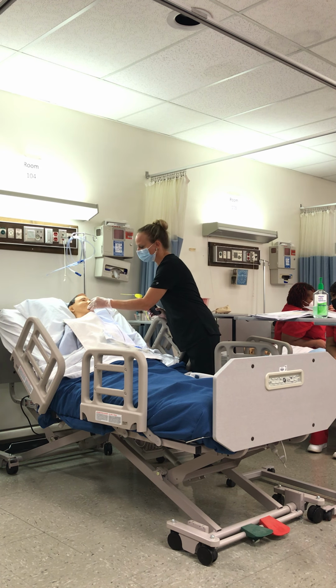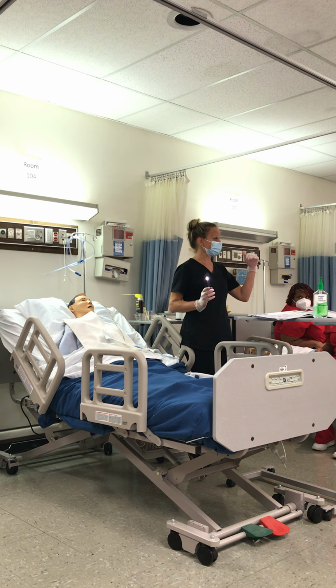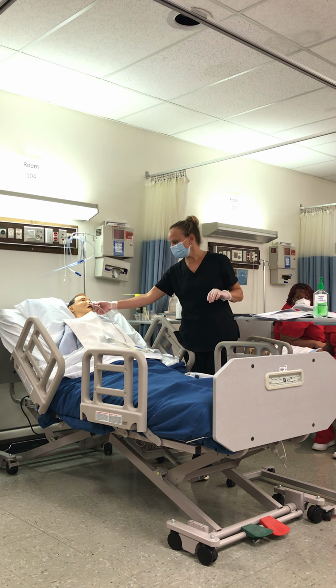If I started meeting some resistance, remember, we want to be going down and back, so you rotate this tube. A lot of times, just rotating it will change the position of that tip, and it'll pass on, okay? That makes sense? So rotate the tube.